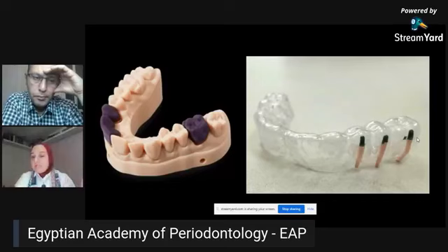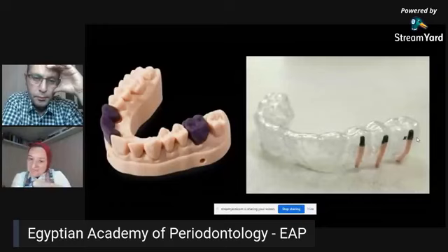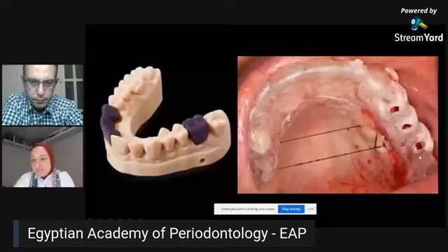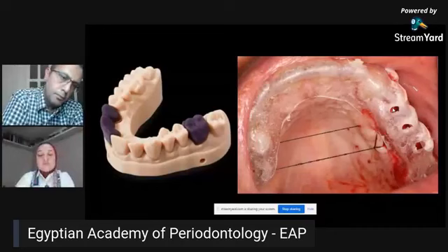It's not a hassle to do it. I mean, it's not something that's really costly or time consuming or exhausting for you or for the patient, but still it will give you amazing results with your parallelism and with your positioning. So I would like to call it a semi-guided placement, especially with all the teeth missing. And then you do some occlusal holes in the middle of the three teeth you want to place. And you can see here the gutta-percha on the buccal surface. And you can use this for, not the pilot drill, just the initial point that you put before continuing your drilling. As you can see here.